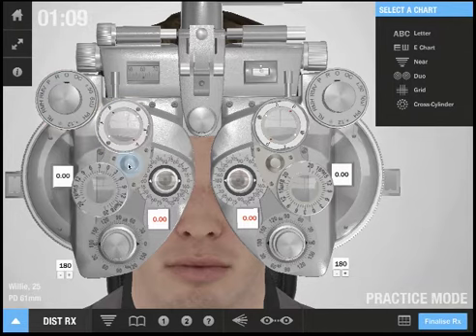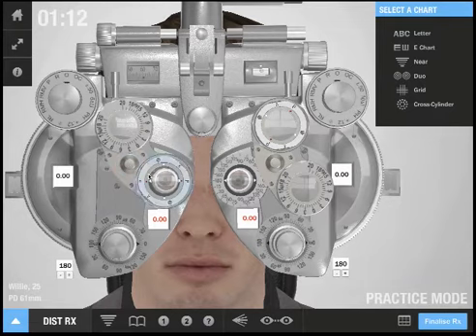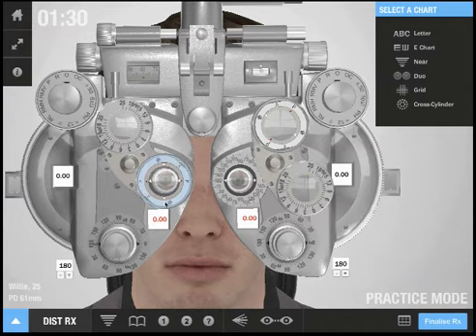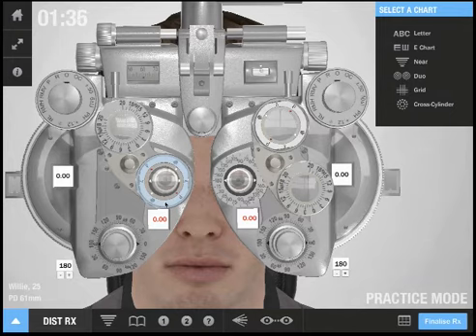Here I can toggle the JCC on and off. I can flip the JCC. Here I can adjust whether the JCC is used for refining the power or the axis of the astigmatism.